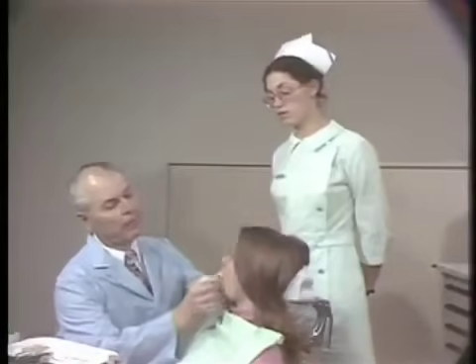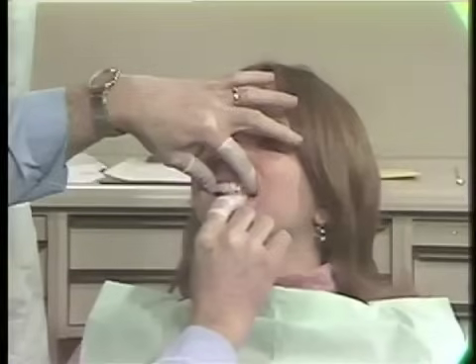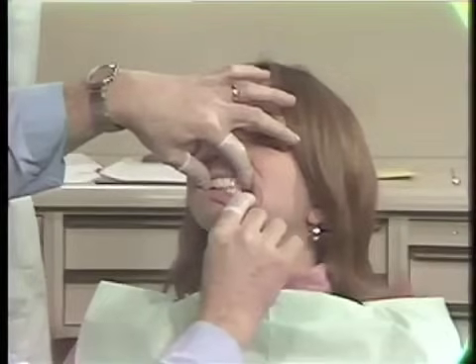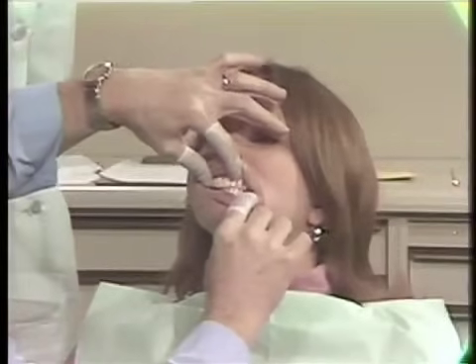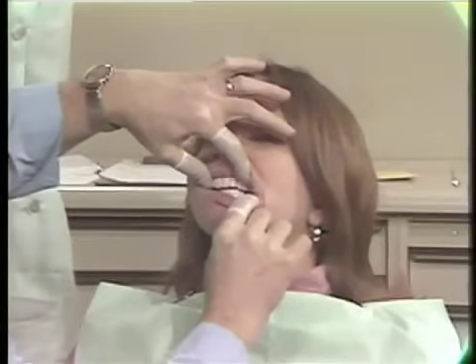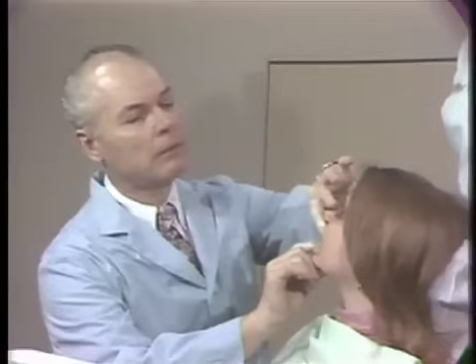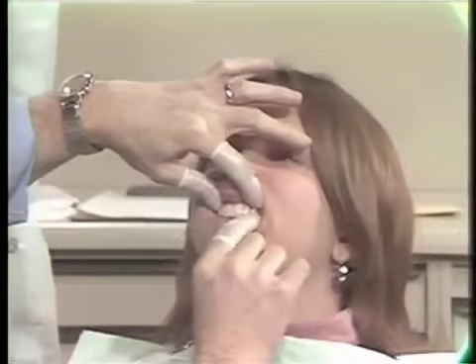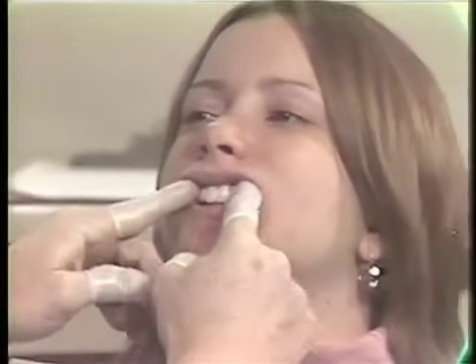We'll take a look. I'd like to take a look at your mouth, please. Close your teeth together. Tap your teeth up and down. Move sideways please. Oh yeah. Do it again. Hold it right there. Tap up and down please. Back teeth together. Come out the other way. Tap up and down. Back teeth together. Grit your teeth sideways. Again. Tap up and down.